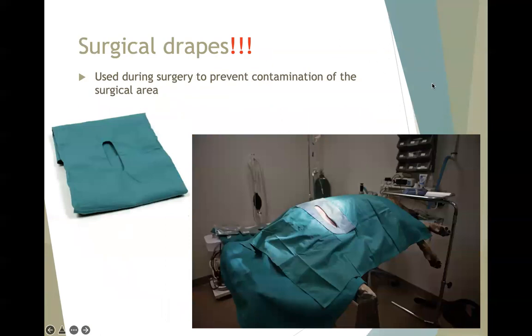Last slide for the day. So we'll stop on this. In the next lecture, we'll get into talking about sterilization instruments. So last of our miscellaneous instruments here, we have our surgical drapes. We know that this is what we're going to use to drape over our patient to help prevent the contamination of that surgical area. And we can either do that layer of towels first, or we can double drape using those Backhaus towel clamps to clamp it into place so that it's not moving.